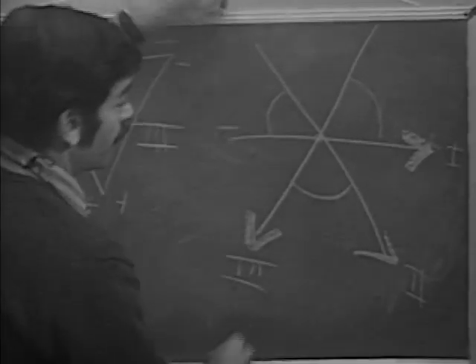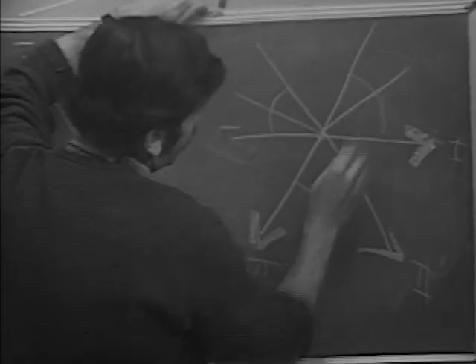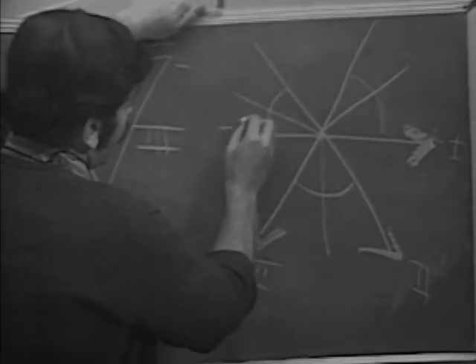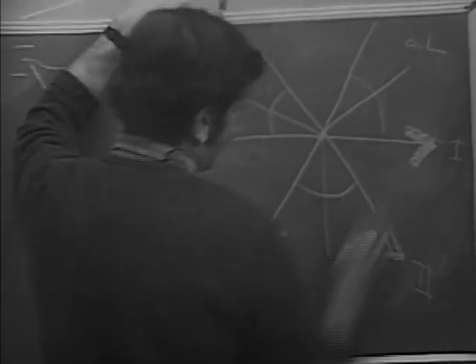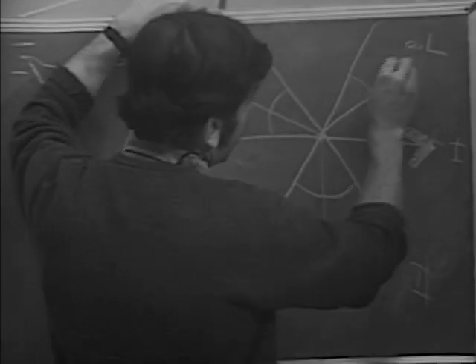So that should be easy to remember. And just remember, they bisect each of these leads. So this would be AVR going to the right arm, AVL going to the left arm, and AVF going to the foot. And these are the positive end of each of these things.